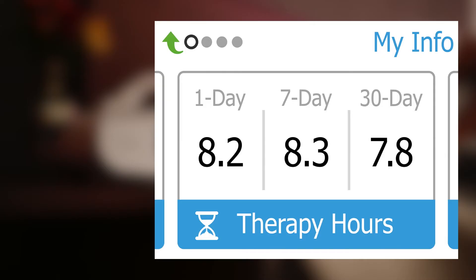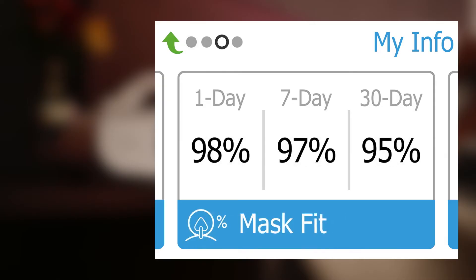Under My Info, you'll find treatment information screens, such as therapy hours and mask fit. For greater detail about these, please view Understanding Feedback in the user manual.